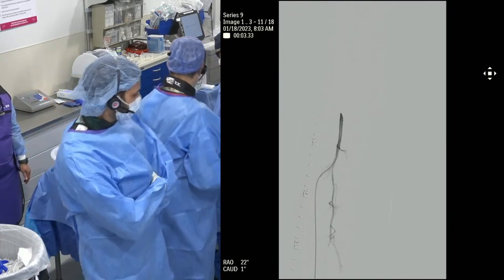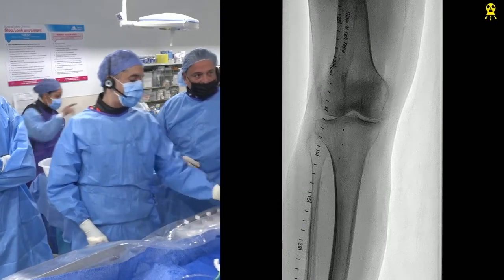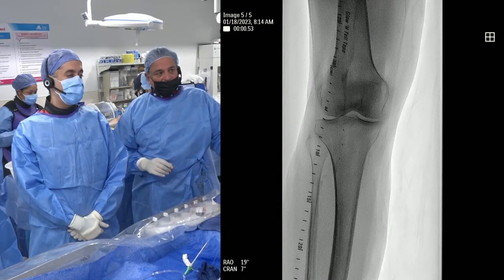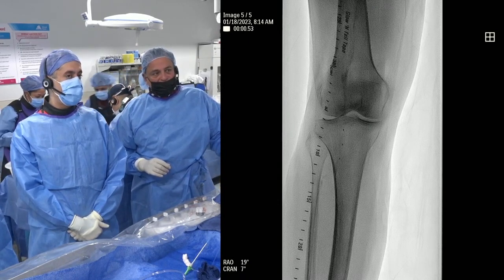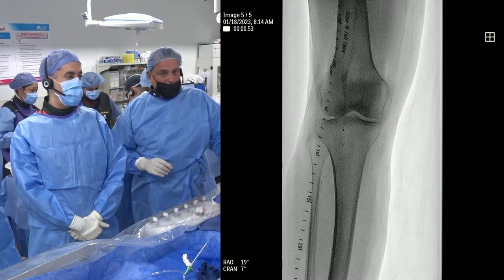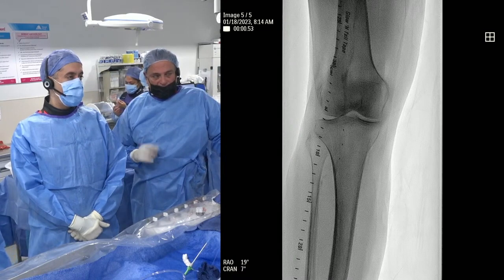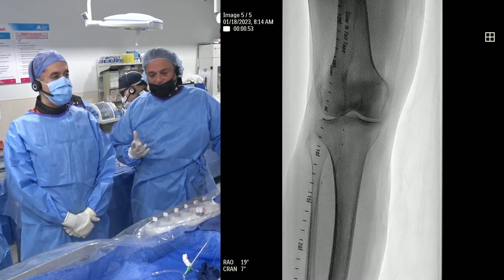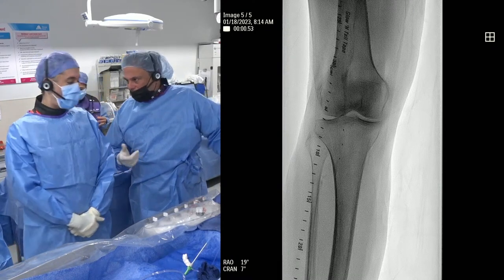So Srini, you've done these cases. I know you wanted to go through the posterior tibial, which we could have, if we really wanted to try. In this case, we thought we'd cross from below and then deal with it. I'm not certain this is going to be a major issue in terms of putting a sheath in here. Obviously, we're going to give some cocktails through the side port of the sheath while we cross, but we're not going to put a sheath in until we actually physically cross this. So, in terms of crossing, Karthik and Raman, what are you thinking? Your wires and stuff like that.